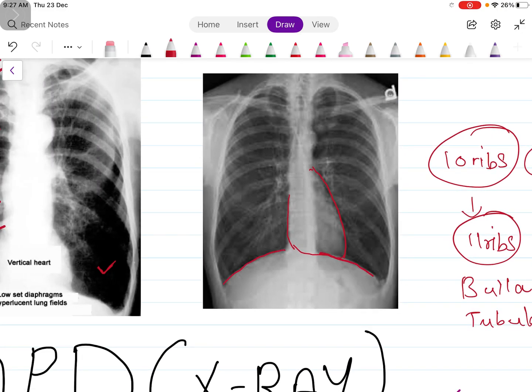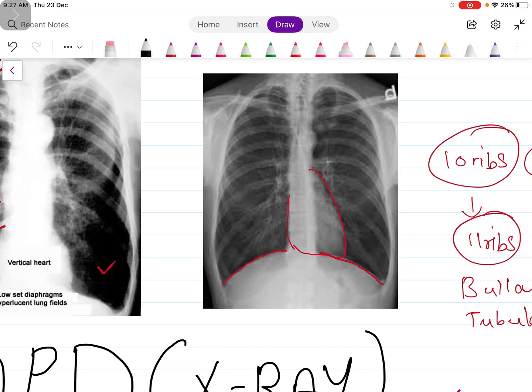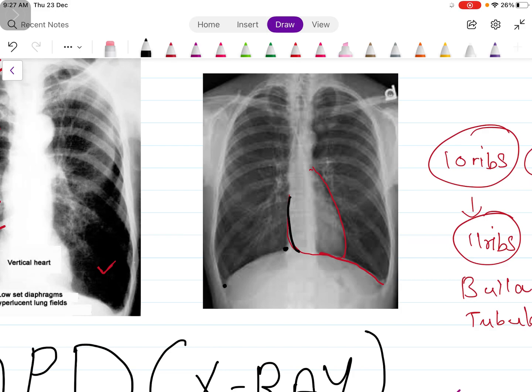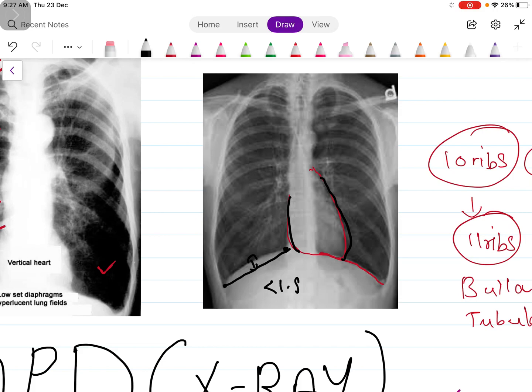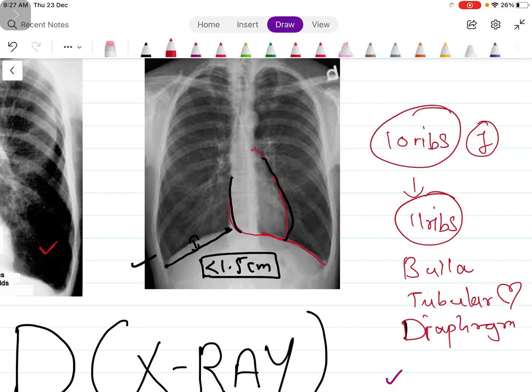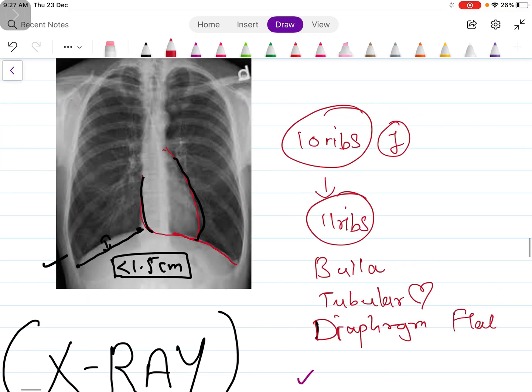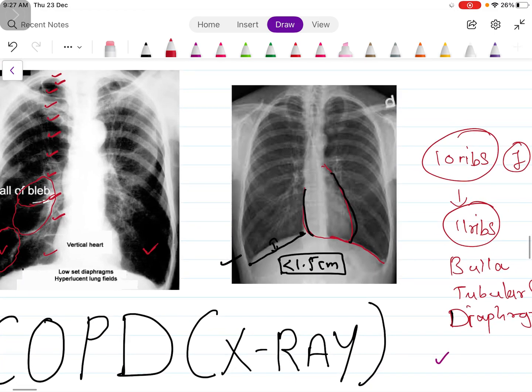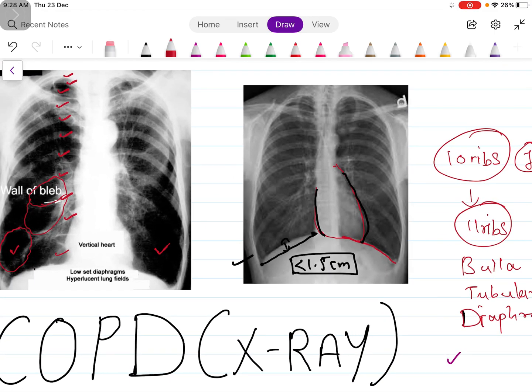And you can see this diaphragm, see this right and the left. There is not much difference between the height of the right and the left diaphragm, it has almost reached the same level. You can also see technically the diaphragm is pushed downwards by drawing a line here from costophrenic angle to costocardiac angle. If this comes out to be less than 1.5 centimeter then we can say that diaphragm has been pushed downwards. And you can see here it will be less than 1.5 centimeter. So again we come to the finding that diaphragm is flattened.